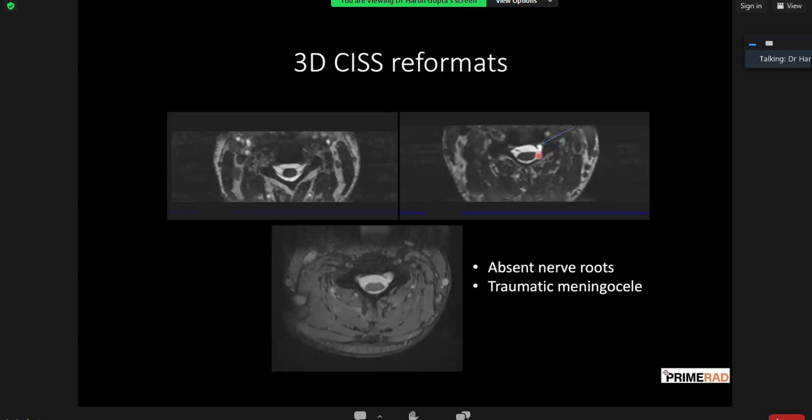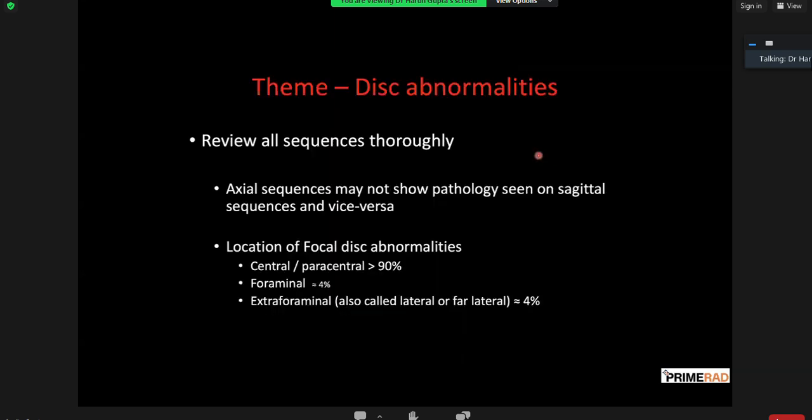Depending on the trauma, subtle findings may be there in pure ligamentous injury, such as just widening of the interspinous gap and subtle kyphosis. History becomes very, very important. If you're suspecting brachial plexus injury, do proper sequences. And in rigid spine, be very careful. You might need both CT and MRI imaging.